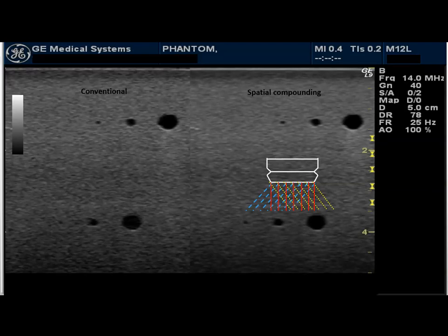And if you look carefully at this, maybe on this example down here it looks a little bit clearer than this one. Honestly, there's not a lot of difference in these images. You can see they've got their focus right between these two phantom tubes here, so it's kind of hard to say exactly how the improvement has helped it. But it does help it a lot. You can play around with it in the lab and check it out, and you'll see that it does help you.